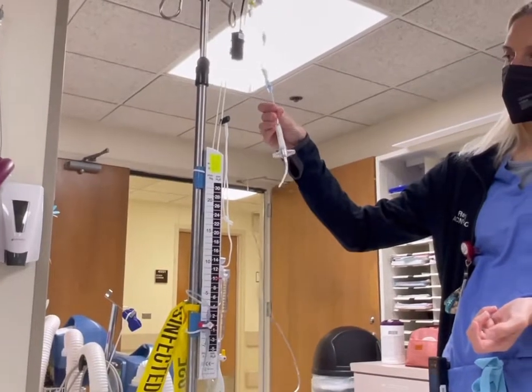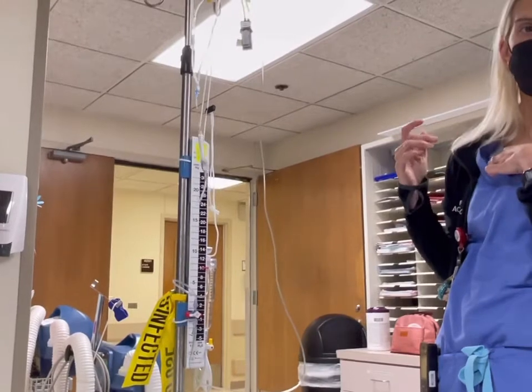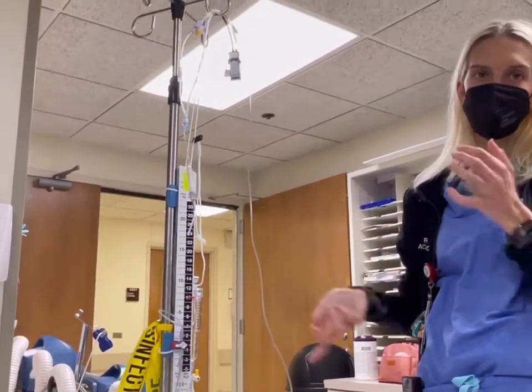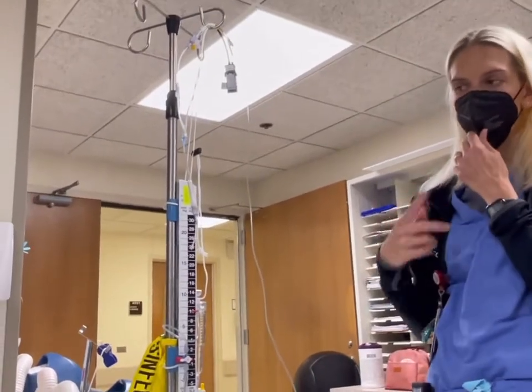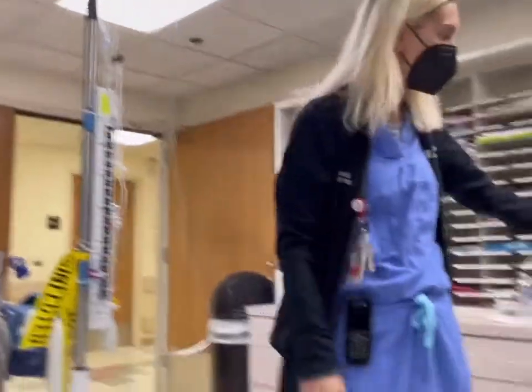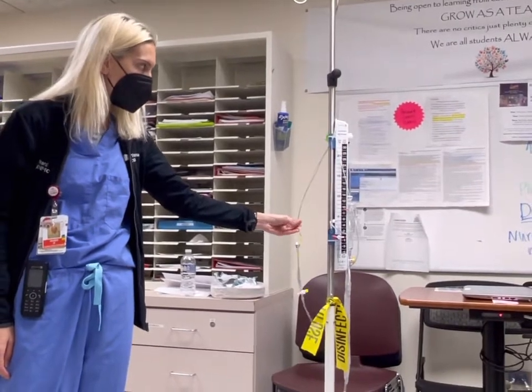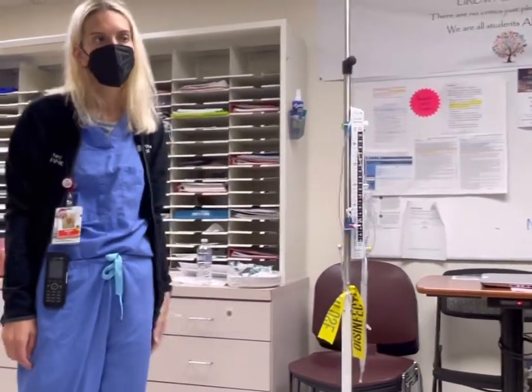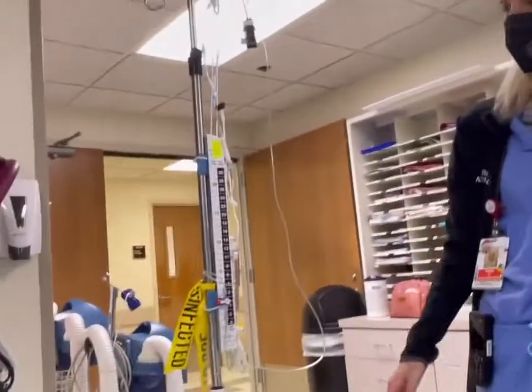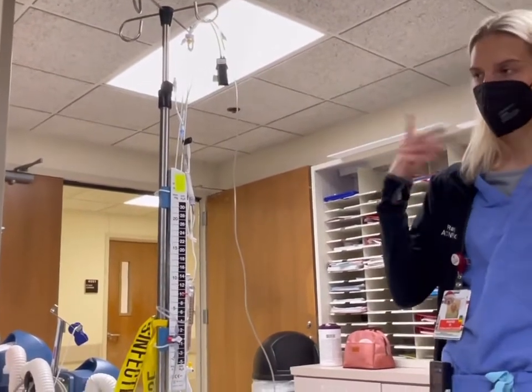I think it's just something he likes to use because he can decide whether he wants to drain or not drain. If he doesn't put it in, he might not have the option to drain or not. So I think it just allows him to critically think what he wants to do with the patient. Whereas if you just use the regular EVD drain, you can only drain; you can't monitor and not drain. You're going to constantly drain. I mean, we could not drain and just clamp it, but I think that's probably why he likes using this one over, it just lets him think through the process.